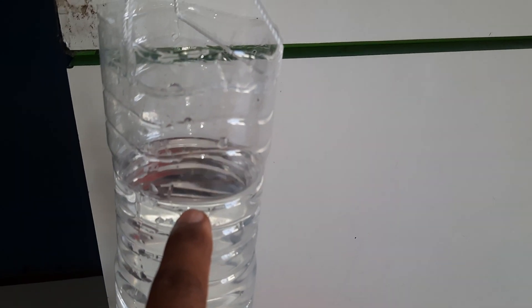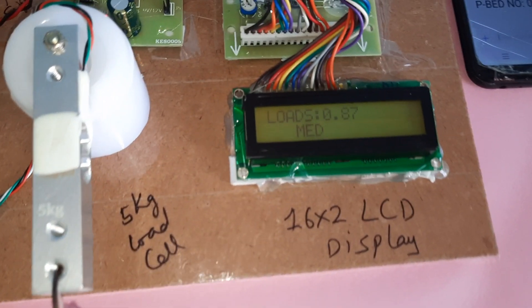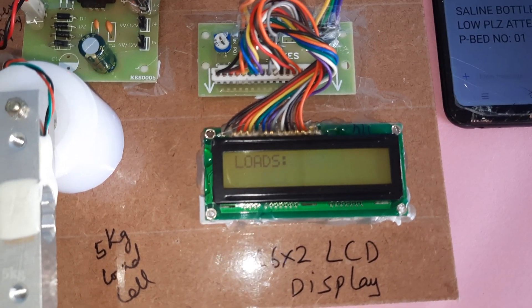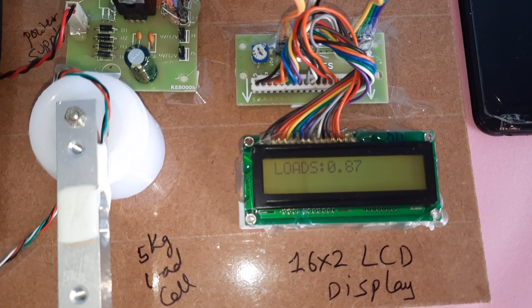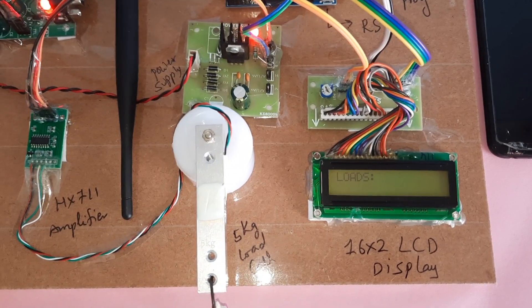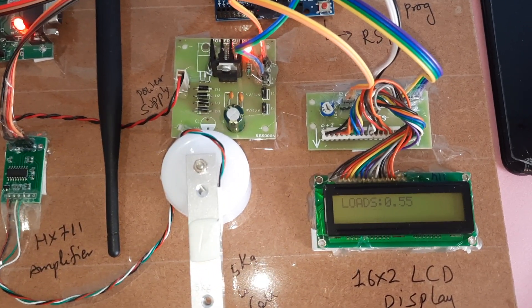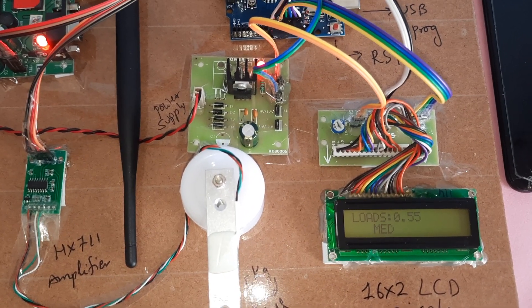Now the water is there. Whenever it reaches a certain level, it will show as 'MID'. Once it reaches 50% and below, it shows mid; 40% and below it will show as 'LOW'.